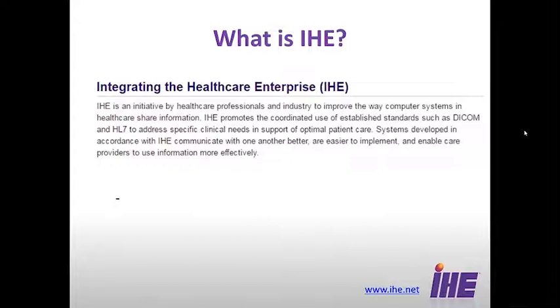So what's IHE? We toss around that acronym a lot. It's Integrating the Healthcare Enterprise. I simply summarize it as we are interested, every single group in IHE, in improving connectivity and interoperability, with the idea that this will help us do better treatments for our patients, and that's across the board.